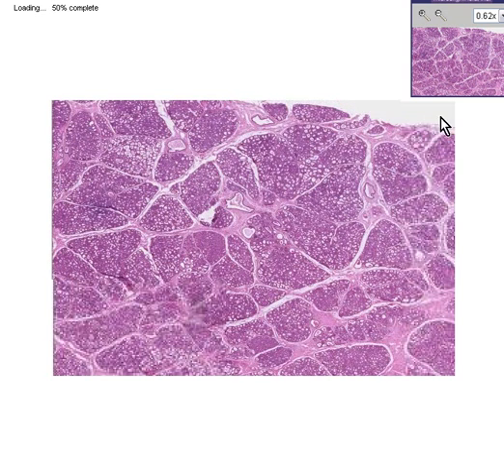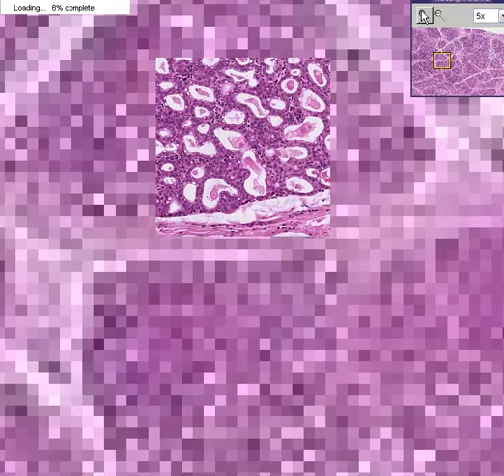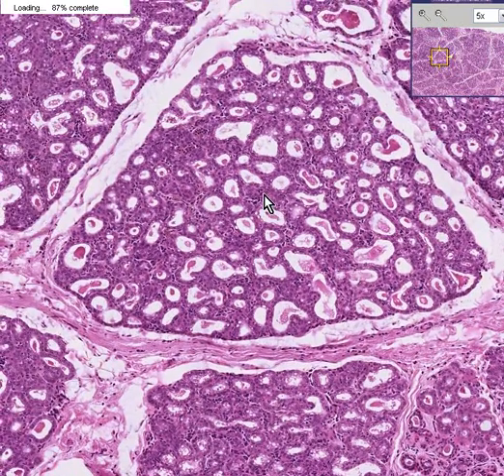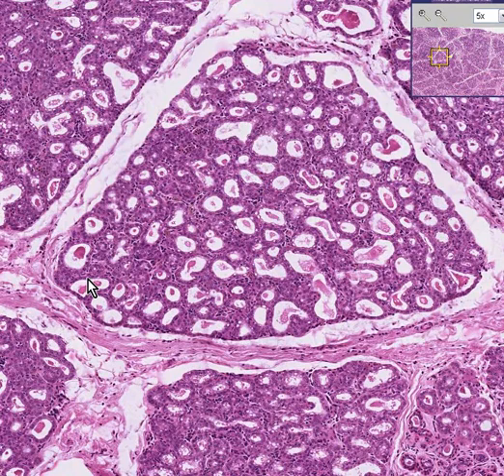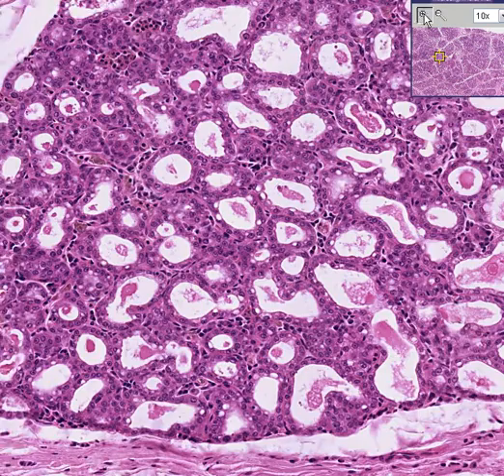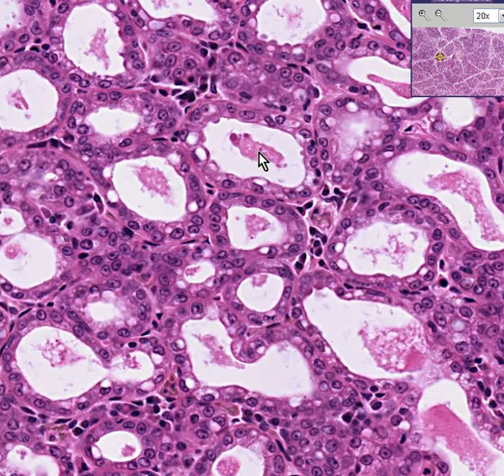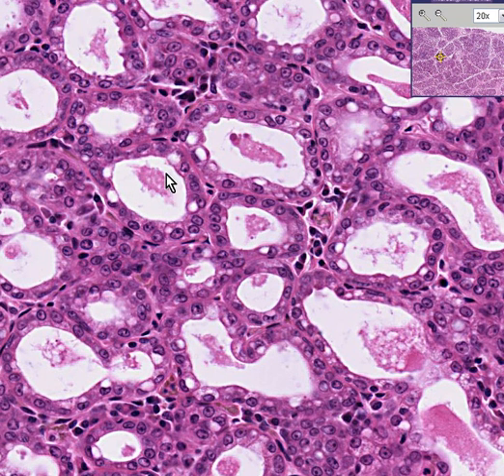In addition, let's zoom in on these lobules. Please note that not only does the glandular or lobular component comprise the vast majority of the breast tissue, but most of the acini are significantly distended by this proteinaceous white material, which for lack of a better word we can call milk. This is milk distending the lobules of the breast. This is a lactating breast.